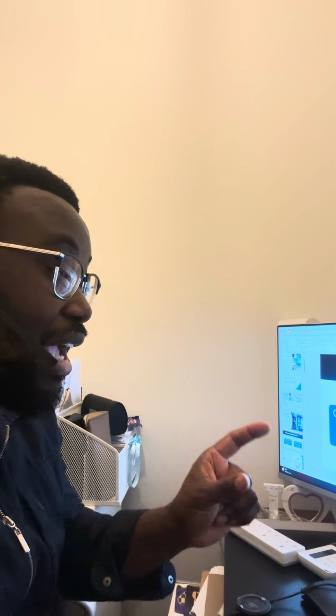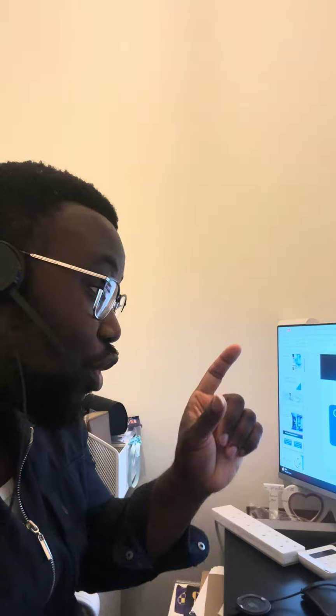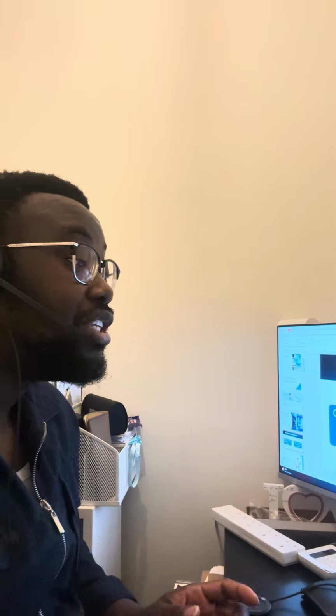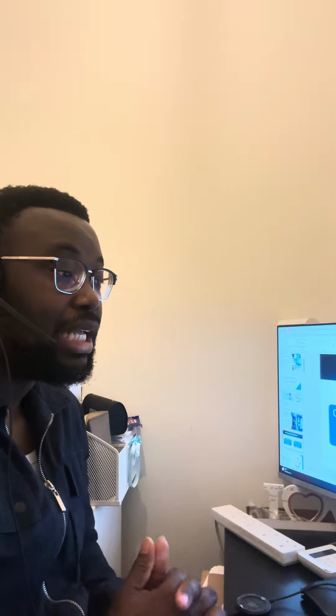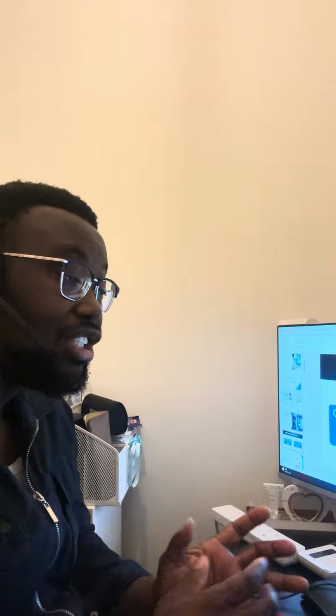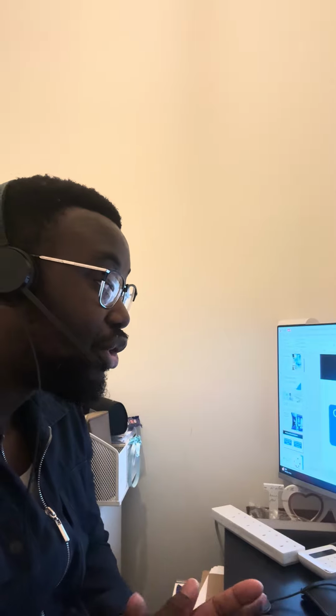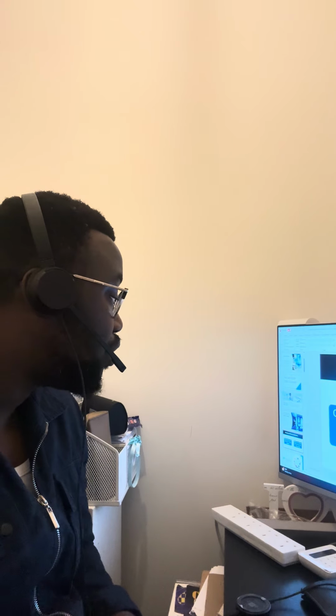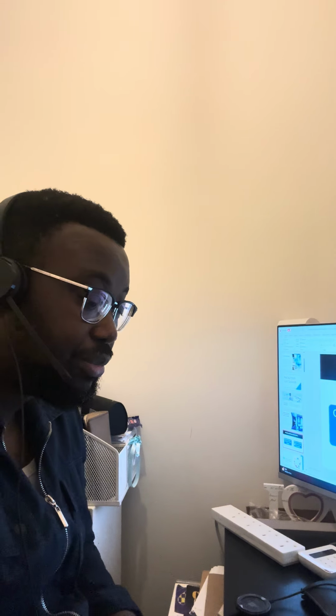You may not have the ability to copycat yourself. You may not be able to photocopy your own denture even though you are the same person doing the denture. Okay, so that is one of the things that digital dentures have eliminated for us. There is a high level of accuracy and efficiency in the denture production and the workflow.